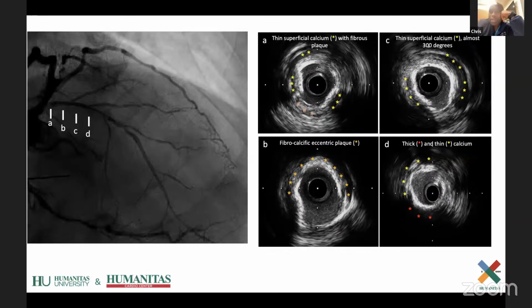Yeah, when I saw this, my first thought was rota, especially when going towards a little more distal where it becomes a little more tapered. I was wondering how far down you did IVUS, because in that mid portion around the third diag, it seems like it's a little heavily calcified as well. But I would have gone to rota initially on this.